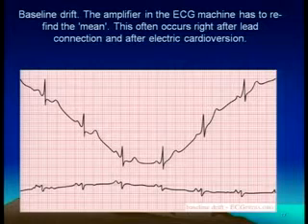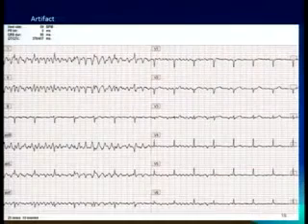Now, baseline drift. You see such a recording, and you wonder why this ECG is going like this and up. Of course, the complexes are normal, but this happens especially when there is a change of lead, in certain ECG machines, when you take a long lead 2 and then suddenly change over to another lead. Initially you might have such baseline drift, and it also occurs when the patient has been given a shock and subsequently reverts. You can have such a drift happening in the baseline.